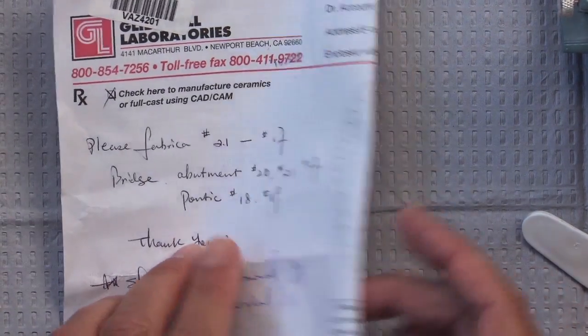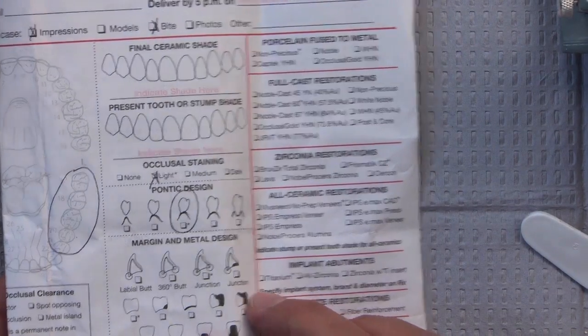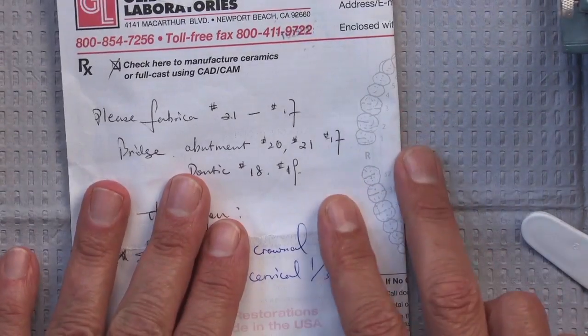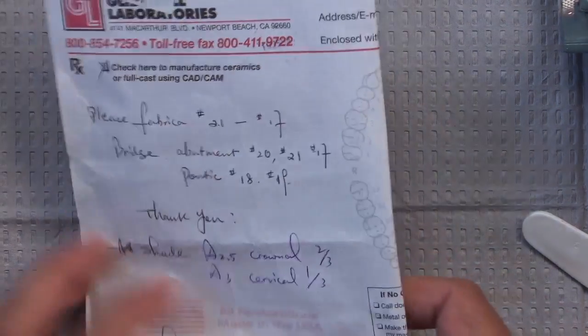It's not quite assumed. It actually says it over here on the lab slip. It has a check mark for it. But the doctor appears to want a PFM bridge here. It's a 5-unit bridge. And so let's go ahead and take a look at the case.